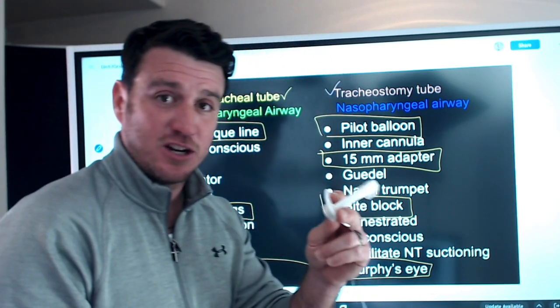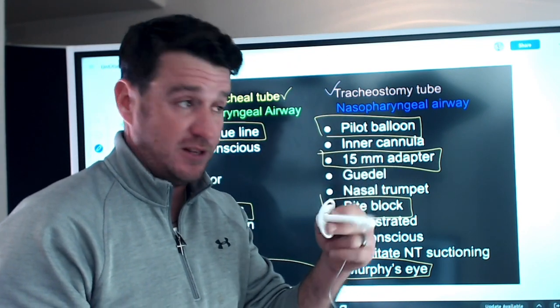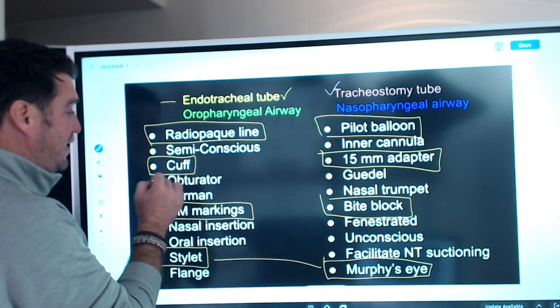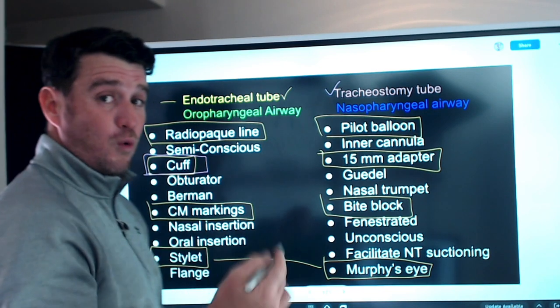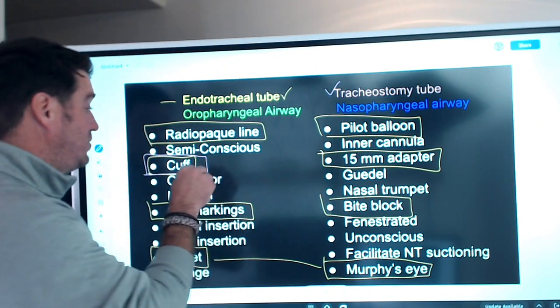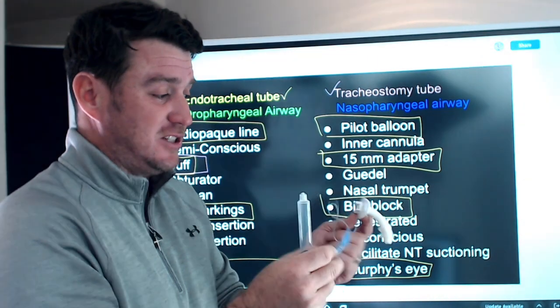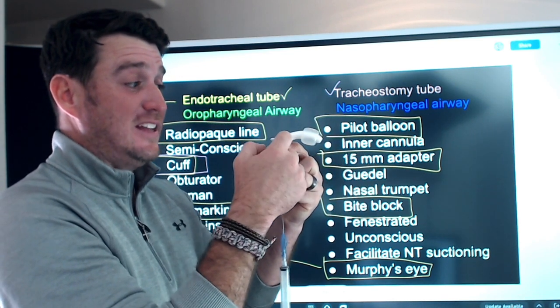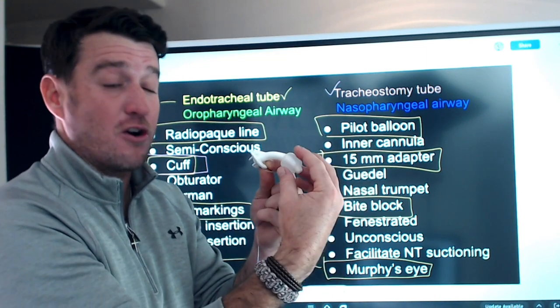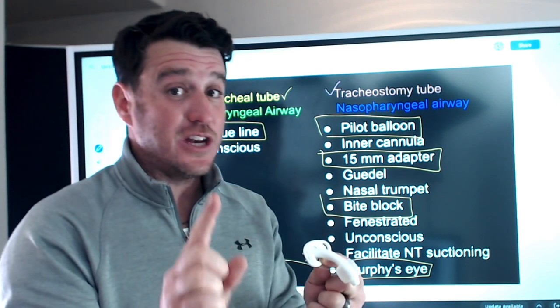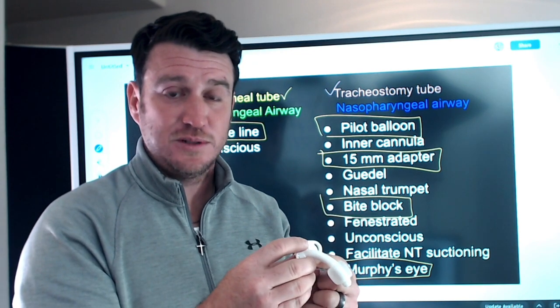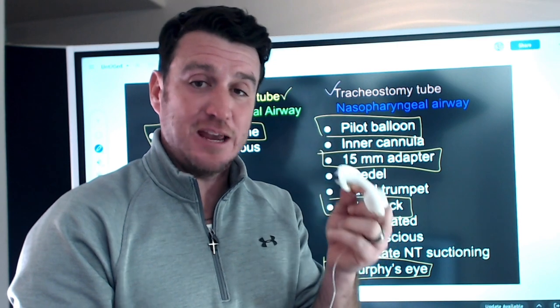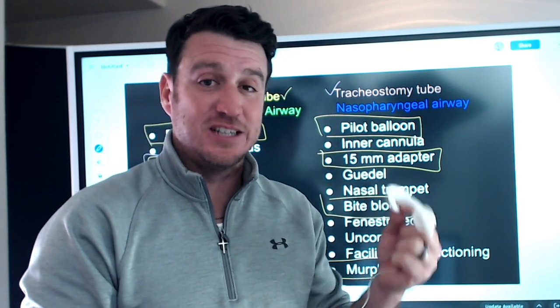Semi-conscious patient does not specifically go with tracheostomy tube. Cuff — here's our first word that goes with more than one airway. Tracheostomy tubes also have cuffs, because they're also used to facilitate mechanical ventilation. When I insert air into this cuff, you can see it inflate. Not all tracheostomy tubes have cuffs — there are cuffless tracheostomy tubes — but cuffed tracheostomy tubes serve the same purpose as the ET tube cuff: to facilitate mechanical ventilation.